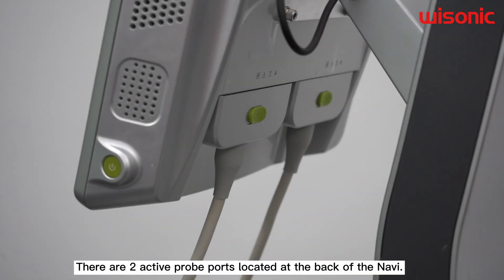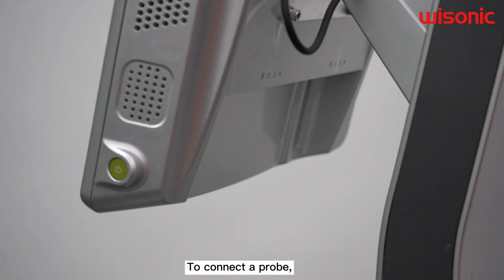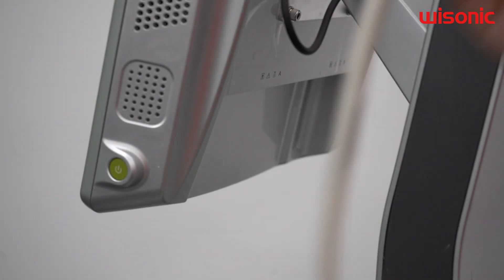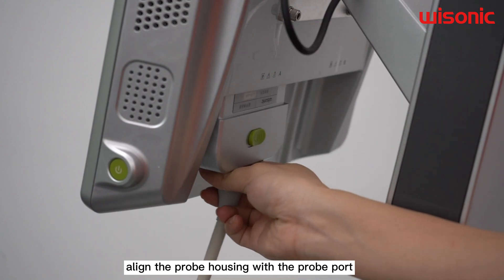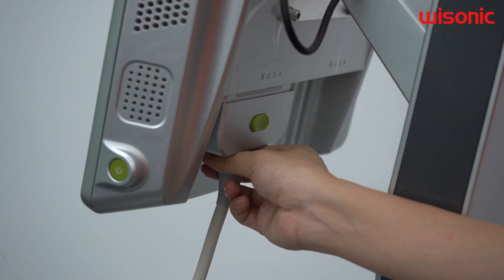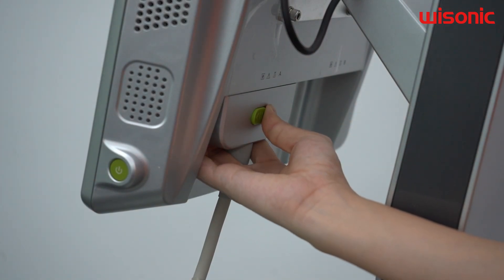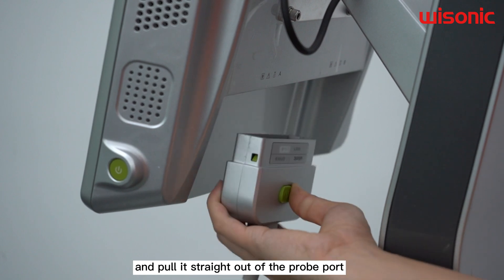There are two active probe ports located at the back of the Navy. To connect the probe, align the probe housing with the probe port and insert the probe. After you hear a click, the probe is locked. To remove the probe, slide the connector lever and pull it straight out of the probe port.